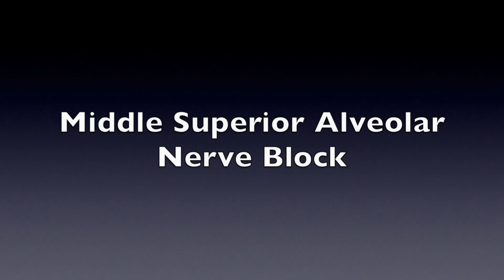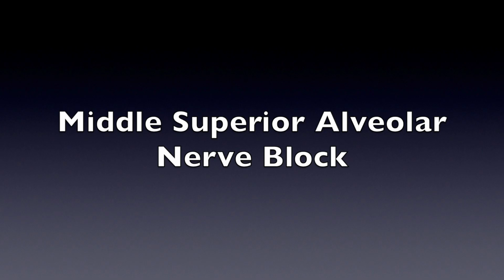Extended verbals for the middle superior alveolar nerve block. The medical history has been reviewed and there are no changes. The vital signs are within normal limits. There are no contraindications for local anesthesia. I will be utilizing 20% benzocaine topical for 1 to 2 minutes, 2% lidocaine with 1 to 100,000 epinephrine, and an expiration date of November 2018.